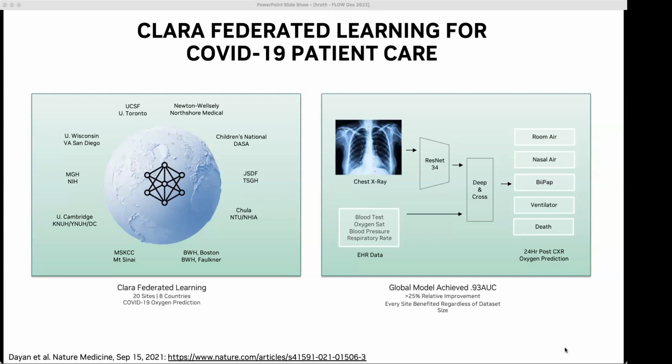And in the model for segmentation in the previous slides, which model has been used? Is it like UNet type? Yeah, this is typically a 3D UNet that we're using. Actually, our team is also very much involved in MONAI, which is an open source platform for medical image analysis, mainly focusing on deep learning. And we have a lot of these 3D segmentation models published there as part of the framework. So we typically use some model from there. Okay, thank you.